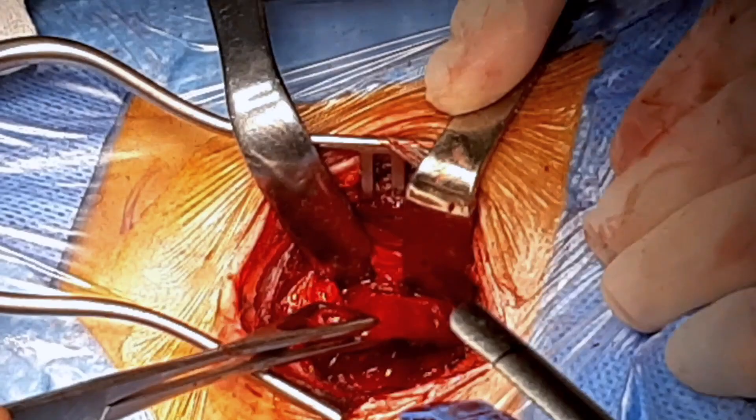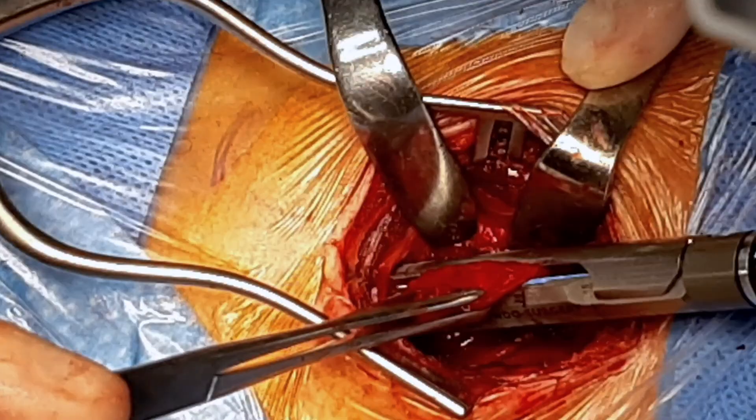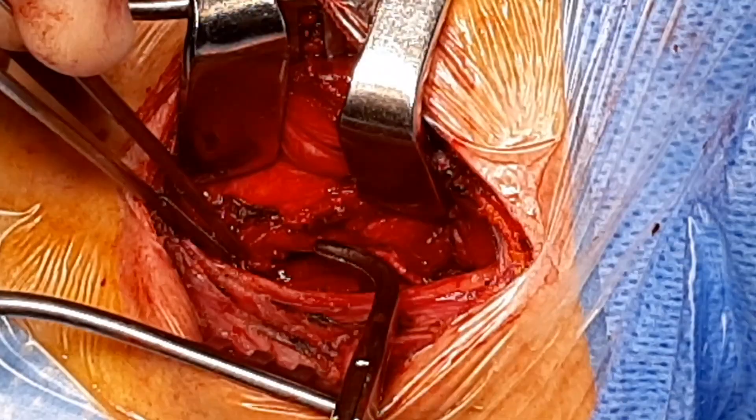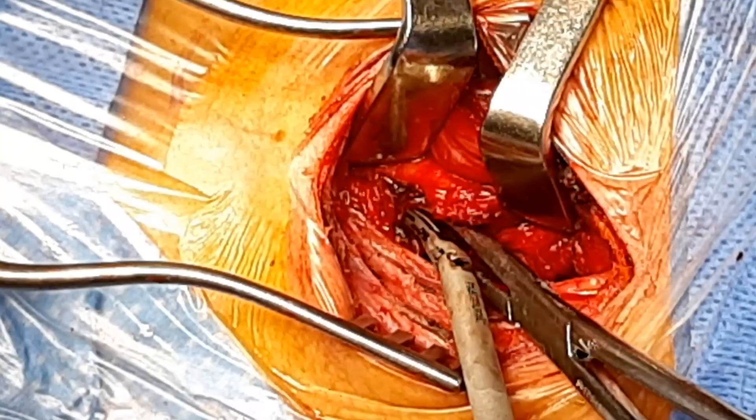We are now ready to staple the diverticulum using the automatic triple stapler, completed with the ultrasonic scalpel. We then extend the myotomy further, as there is additional room for dissection now that the diverticulum has been delivered.